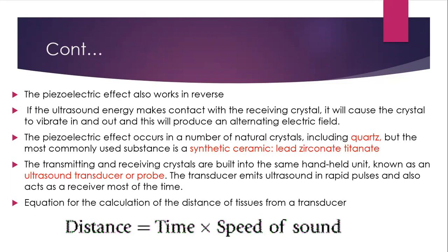So the piezoelectric effect also works in reverse. If the ultrasound energy makes contact with the receiving crystals, it will cause the crystal to vibrate in and out, and this will produce an alternating electrical field. The piezoelectric effect occurs in a number of natural crystals, including quartz, but the most commonly used substance is synthetic ceramic, lead zirconate titanate.